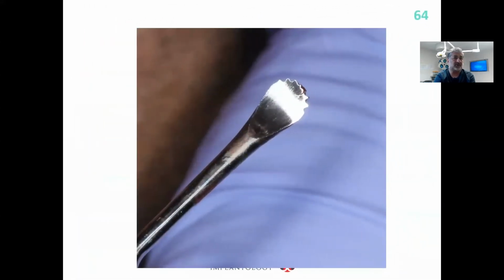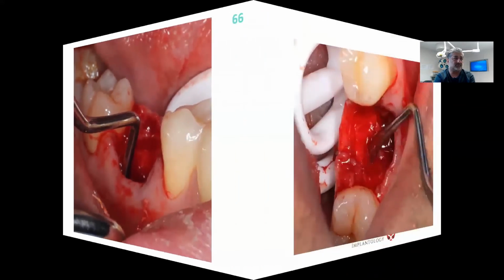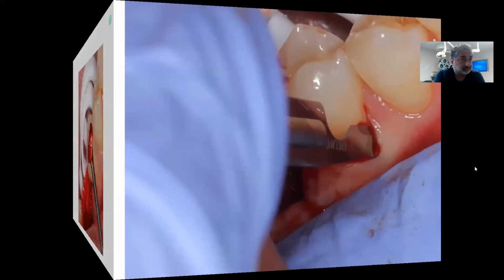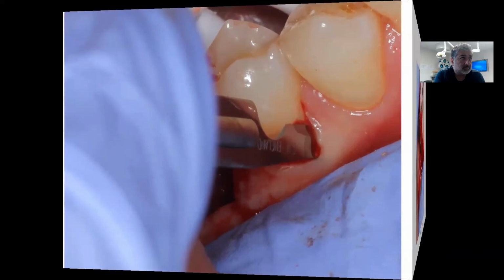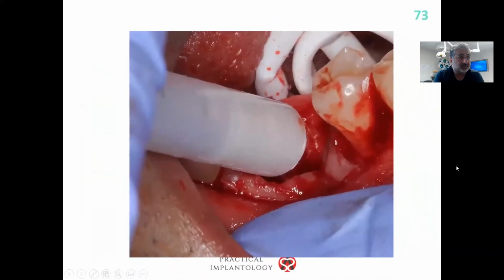I then used my Lucas curette to remove soft tissue. You go down to the bottom of the socket and you clean it from the top to the bottom, and you take out the granulation tissue there, the chronic infected tissue. I had to lift a little bit of buccal flap here against my wishes, but because I was doing ridge preservation, I wasn't too concerned.